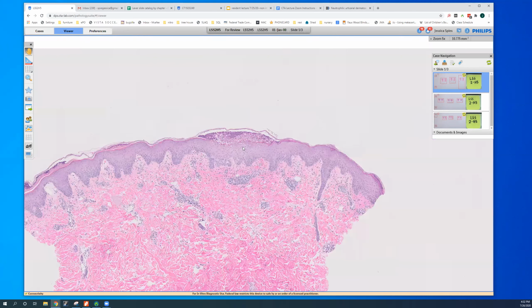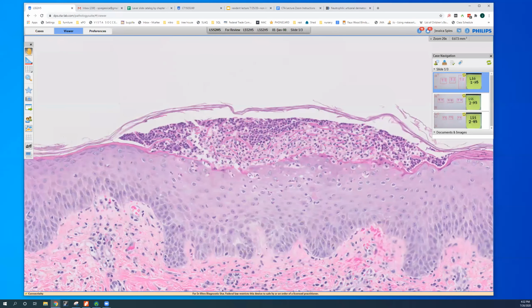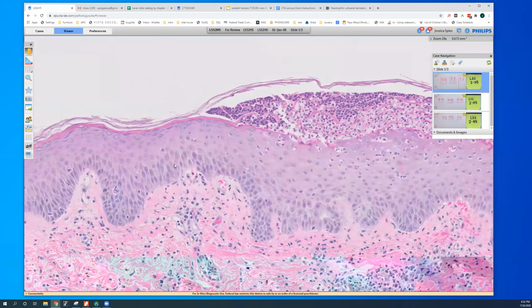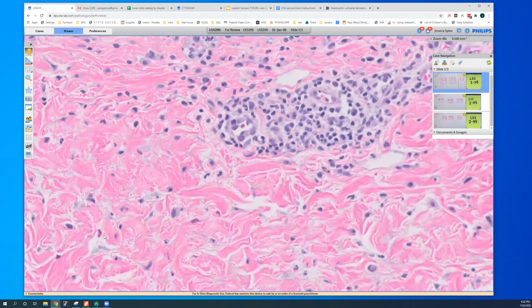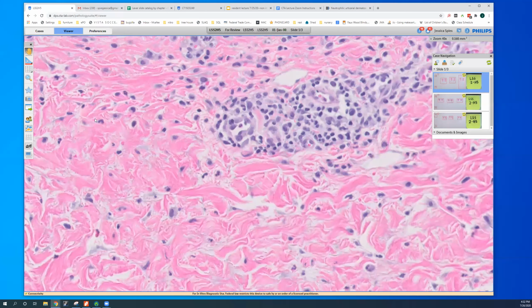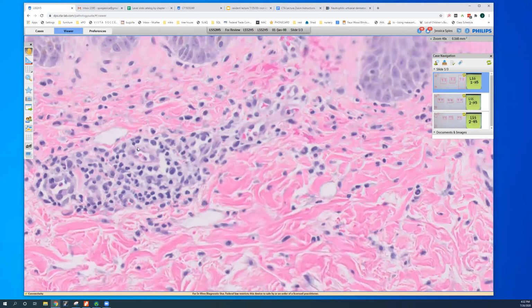And you can see here, this is really acute. It doesn't have that hyperkeratosis of psoriasis vulgaris. It's got a normal basket weave stratum corneum overlying the collections of neutrophils. It doesn't have that marked psoriasiform epidermal hyperplasia. It can have a little bit of spongiosis. It can have some eosinophils, and you can see this is an eosinophil. Often has a little purpura, some extravasated red blood cells, but for the most part, it's lymphocytes.